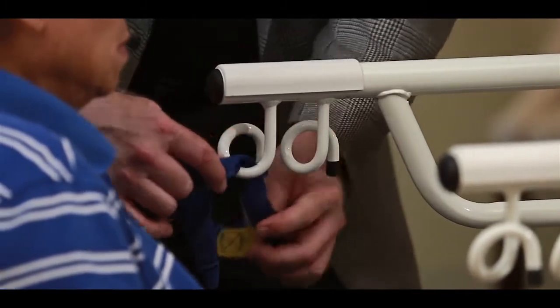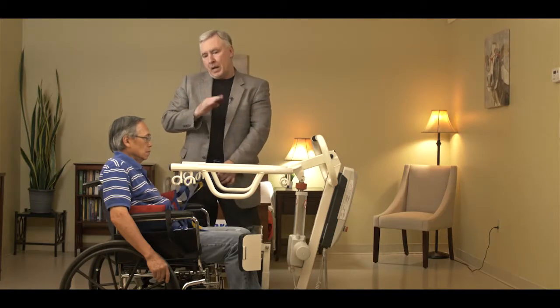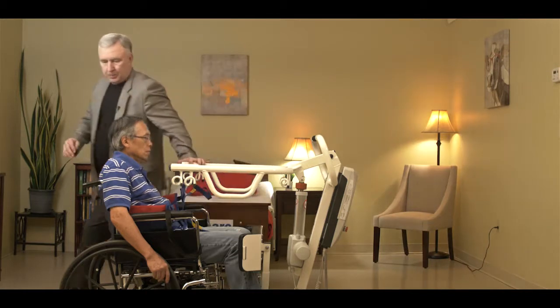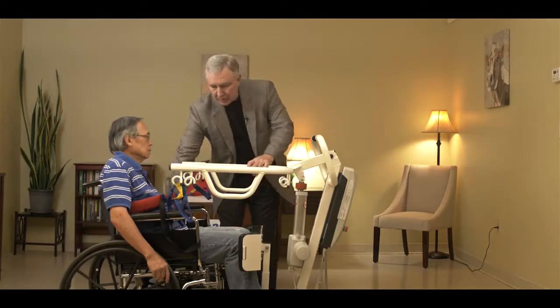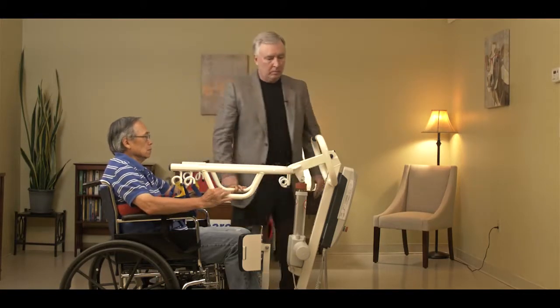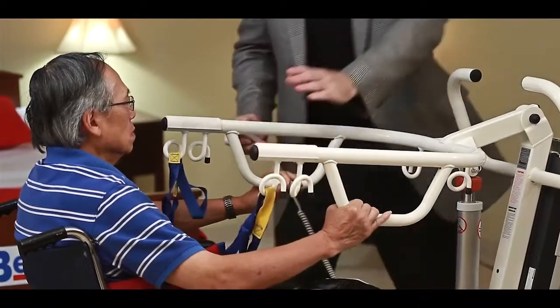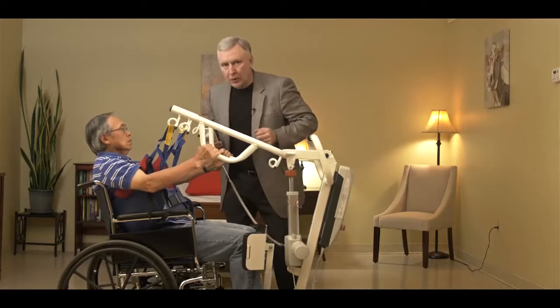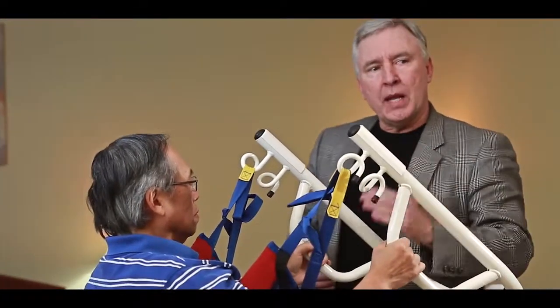There are three sets of loops on the first set of hooks on the SA. The shorter the loop, the taller it stands somebody. The longer the loop, the further away the patient is from the lift during transfer. Once the loops are connected, the patient would place their hands on the handles. Take the remote, hit the up button, and have the patient lean back into the sling as much as possible during the transfer — that's very important. If the patient starts to lean forward and stand up naturally, the belt could slide up underneath their arms. You can see it's pulling the person into a standing position.